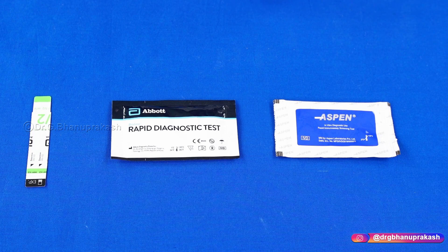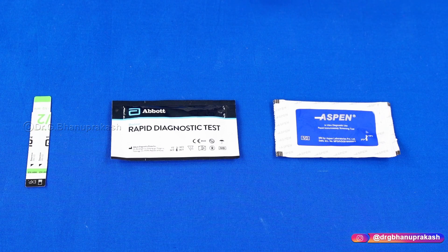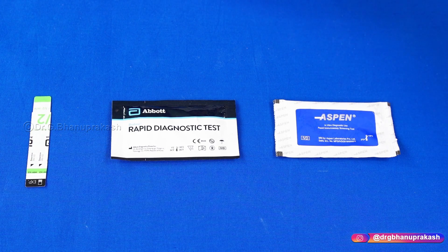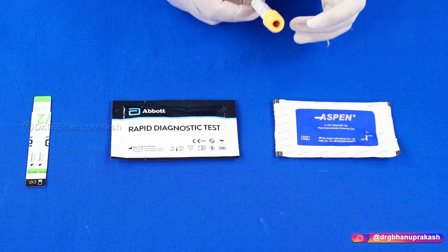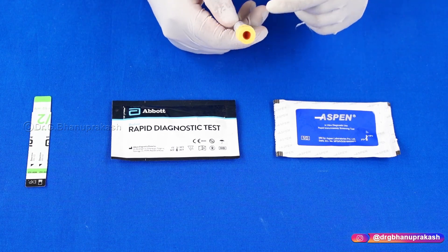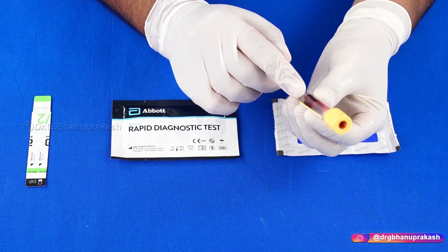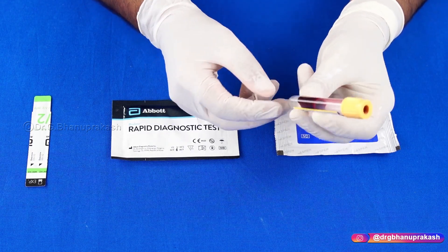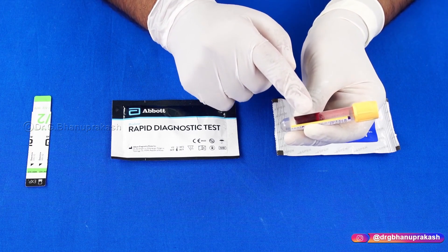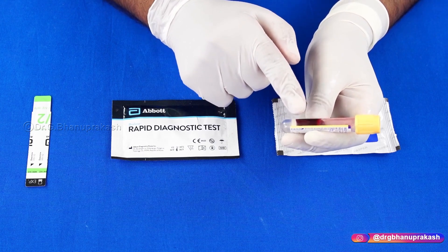Now let us do all these tests, but before doing so, you have to take the patient's blood — at least 2 ml — and store it in the yellow container, which is the yellow vacutainer. The basic ingredient here is just the gel, no other ingredient. Because there is no additive to prevent clotting, the blood clots inside the container. We use these yellow color tubes to assess viral markers.